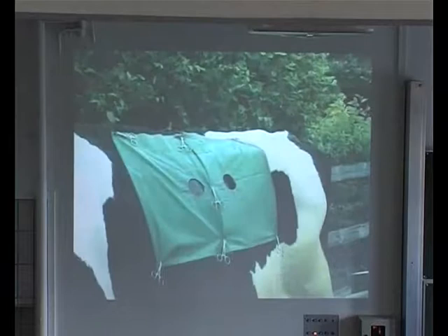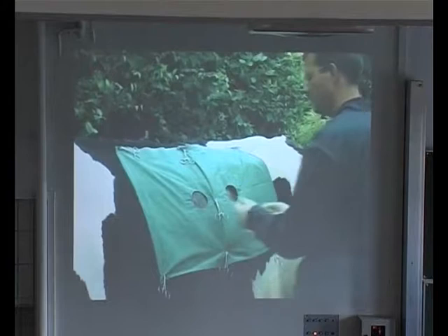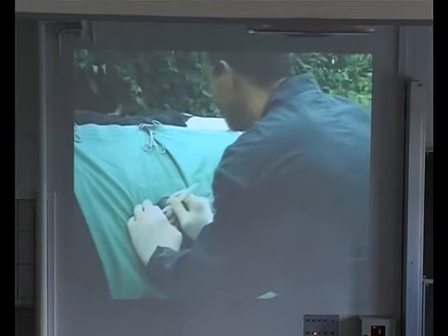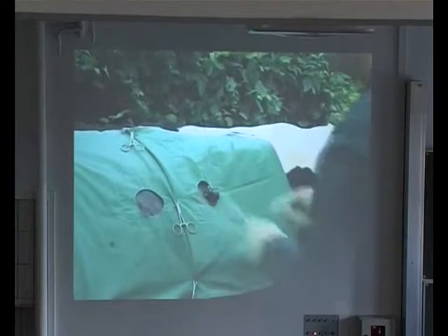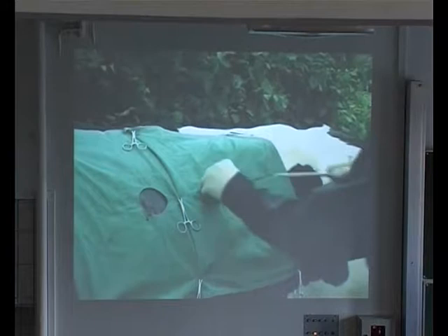We prepare the cow, we shave the 2 positions behind the last rib, in the last or 11th intercostal space, we disinfect these positions and we anesthetize them to later bring in our toggles and trocars. Only very small incisions are necessary, and then we bring in directly a 5 millimeter trocar with the open tube at the head, and we remove the head of this trocar, and within a few seconds we have a passive inflow of air, and we have a fine pneumoperitoneum.